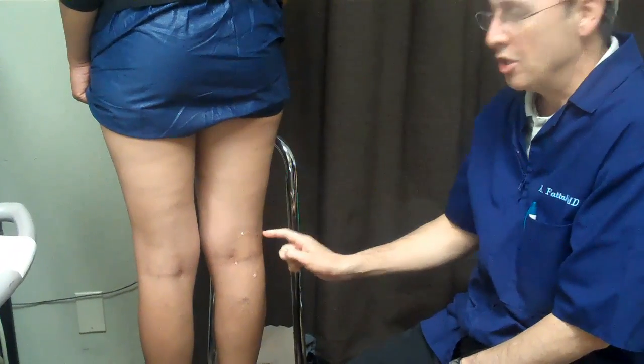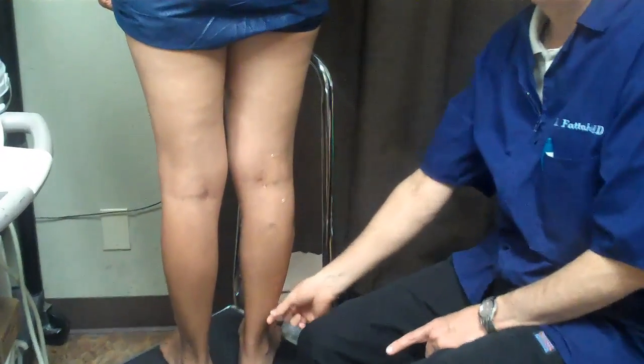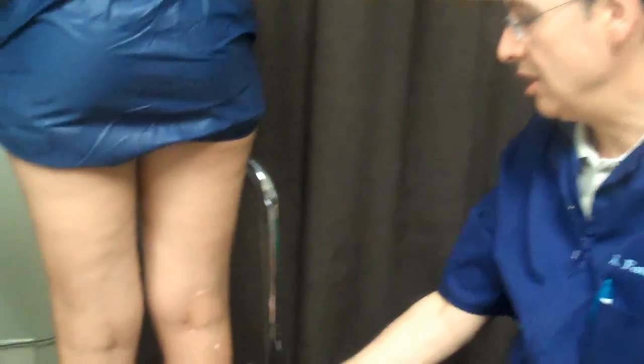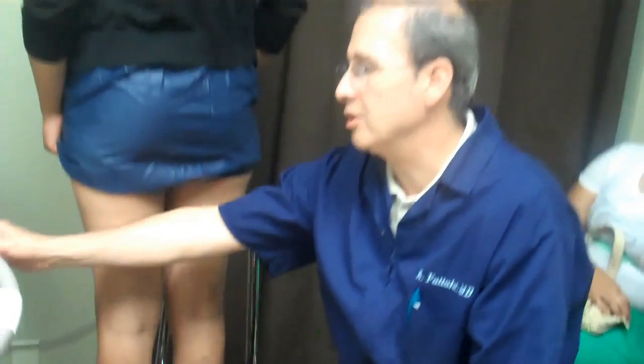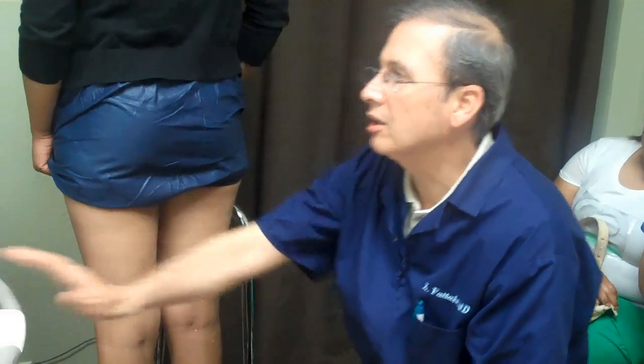The best treatment is ultrasound-guided sclerotherapy. The problem is that right here, deep to the vein, is the sensory nerve that innervates the posterolateral calf — it runs right by that vein. If the injection is not done very accurately and there is a little extravasation, or if there is mechanical or needle injury to that nerve, patients can have temporary or permanent numbness along this side. So be very careful when working on this vein.